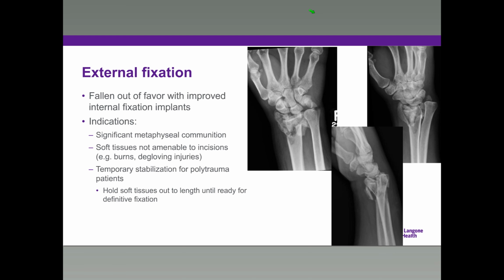And then finally, looking at the X-Fix, it's really fallen out of favor with improved internal fixation implants, but still does certainly have its place. Indications include significant metaphyseal comminution. Like Dr. Konda, I work in a trauma center.